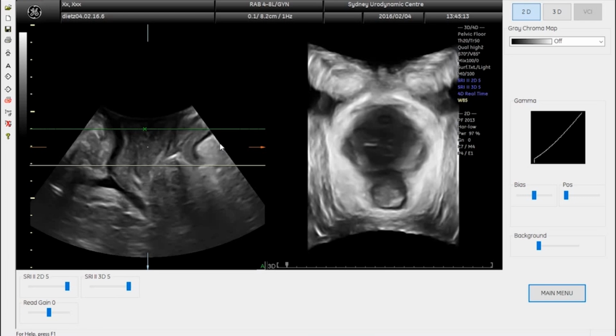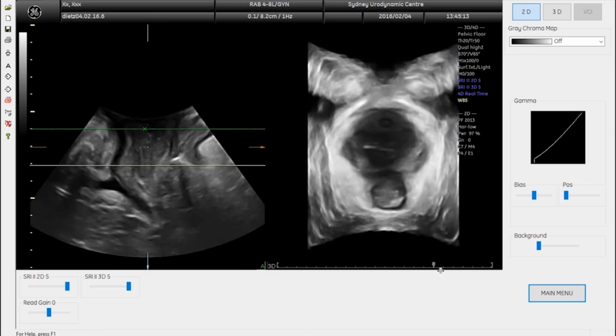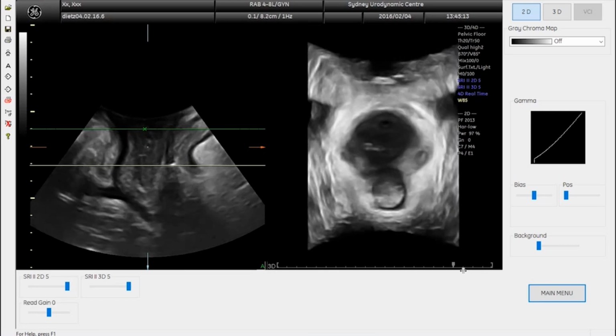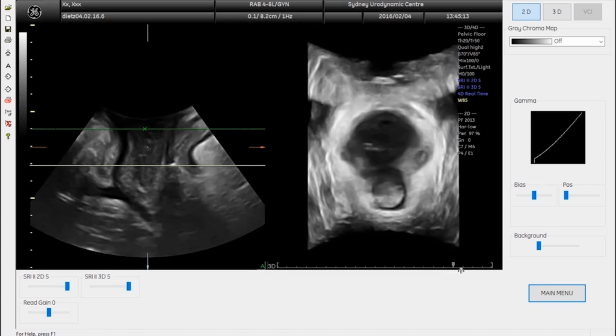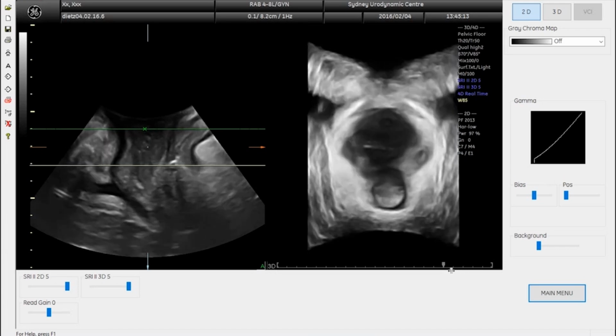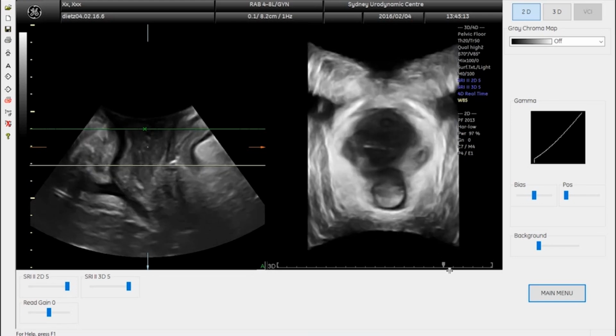It's in 3 dimensions. In order to assess the levator, we want a pelvic floor contraction because that tends to improve tissue discrimination. So this is what we're simulating here with me running the timeline here. That's a pelvic floor contraction. In fact, she does also activate her abdominals, because while to about here, the effect is exclusively one of a reduction of the plane of minimal dimensions, of the minimal distance between the back of the symphysis pubis here and the front of the anorectal angle here. So this distance here has shortened with that contraction from here to there.